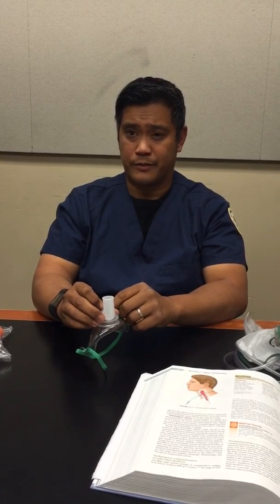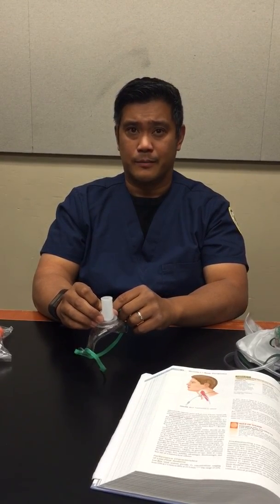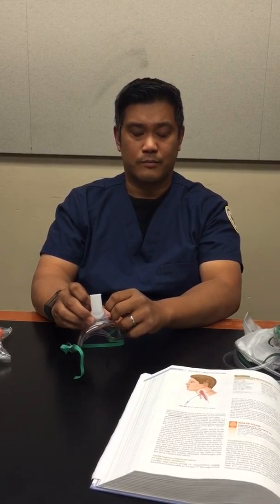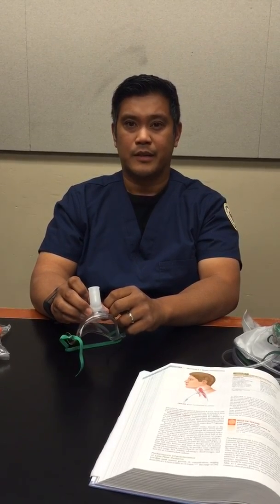The disadvantage to this device is that between 28 and 40% FiO2 is not ensured. The FiO2 can vary from backflow pressure, and there's a high risk of infection. The best use is for patients with artificial airways, basically like this one right here with a trach collar, who need low to moderate FiO2, especially for patients that have a tracheostomy.